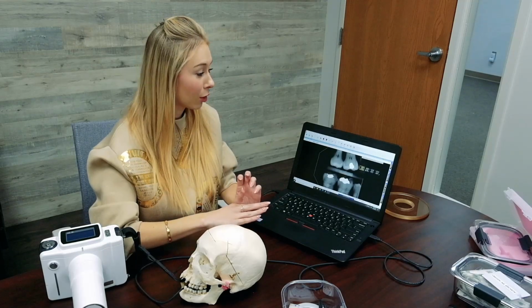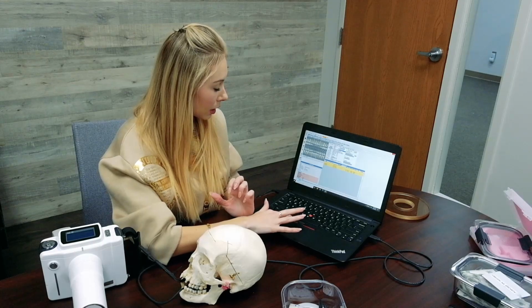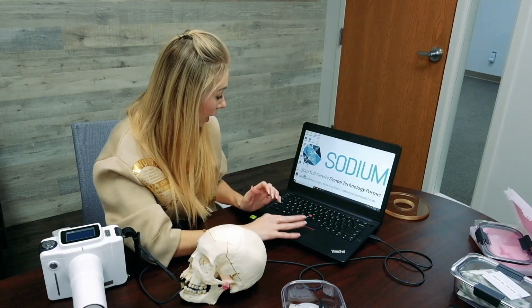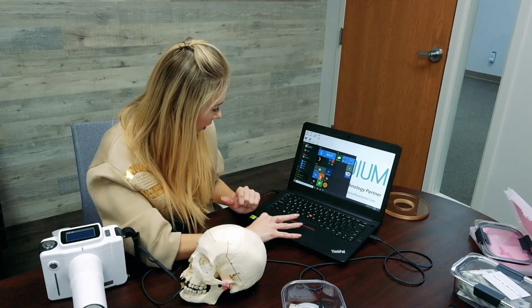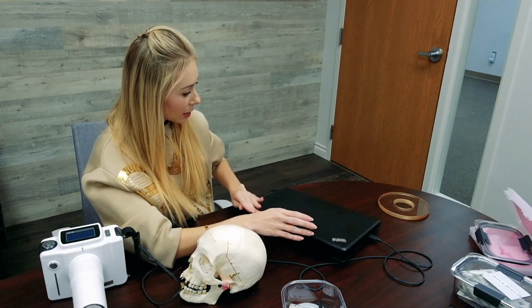So now that I've got all the images taken, I'm now going to go ahead and close everything out. And everything's already going to be pre-saved so that I can go ahead and get ready to shut down my laptop here. And now I'm going to take this home and go plug it in and charge it, knowing that everything will be safe and saved for me. And I will know that it's already been protected. It's encrypted. So if I was to lose my laptop, everything will be saved for my patients.